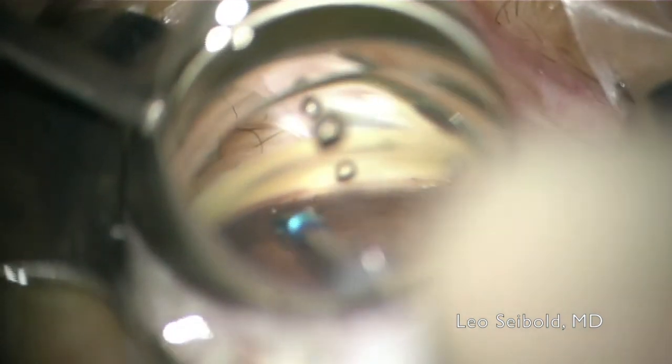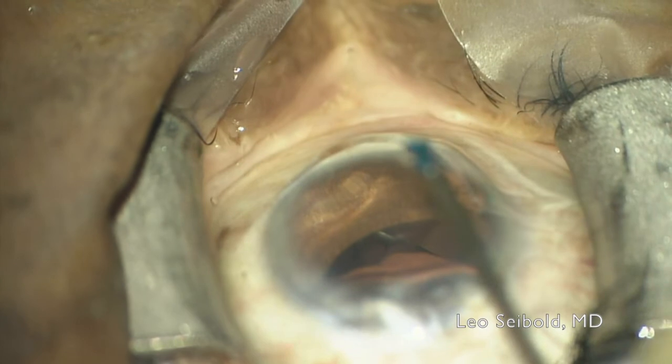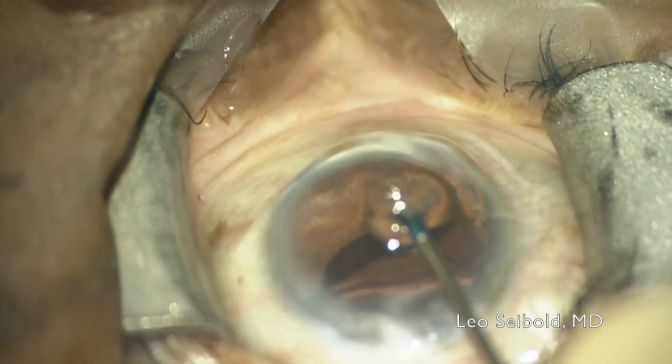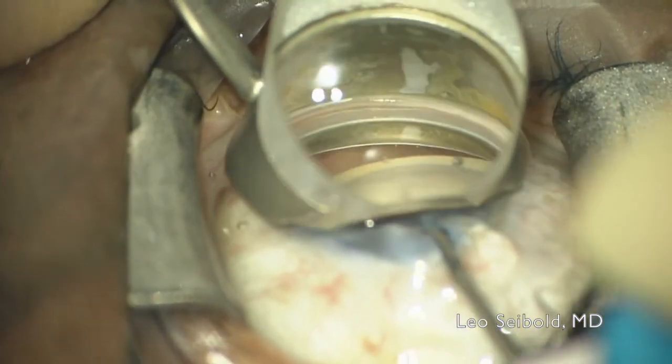Then as we go to the left side with just gentle pressure, you can see a little blood reflux through that goniotomy. As we push the button again a couple of clock hours away, you can see that blood being displaced as OVD is being flushed through the canal, stretching the TM and also flushing through the distal collector channels. So you can perform multiple precision goniotomies across several clock hours of the trabecular meshwork, and it also provides catheterization and OVD injection across several clock hours of the canal of Schlem.